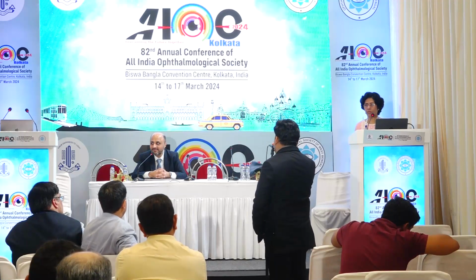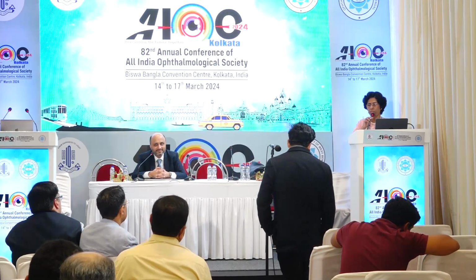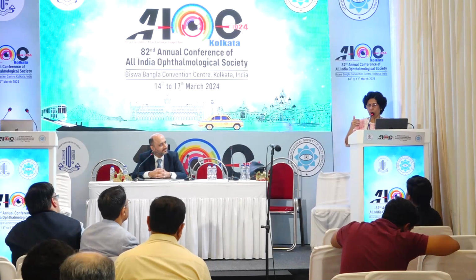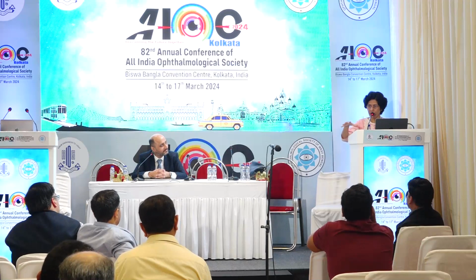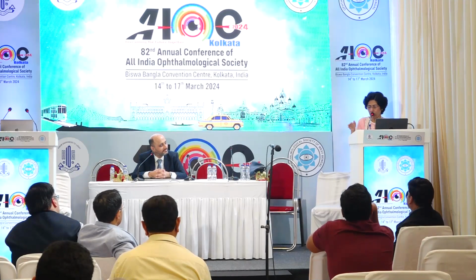Yeah, I try to remove everything, but sometimes if it is at the cost of causing breaks and putting in oil, then I'll definitely leave it. See, you can leave islands of tissue which are very adherent, which you are not able to remove. You can leave a few islands, that does not matter. But you should not have any tissue which is bridging 2 points. Any tissue bridging across 2 points will contract. So even if you have left a very large island which is across superior inferior or across right left, that will contract. So that you should not leave.